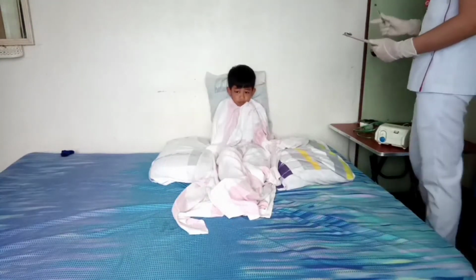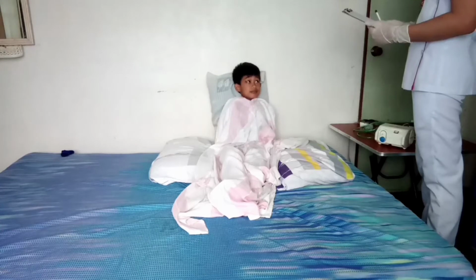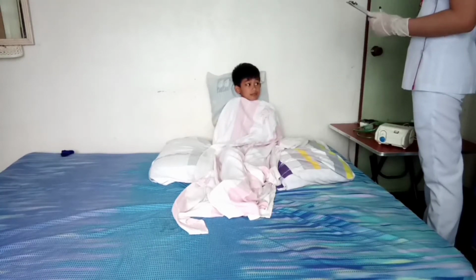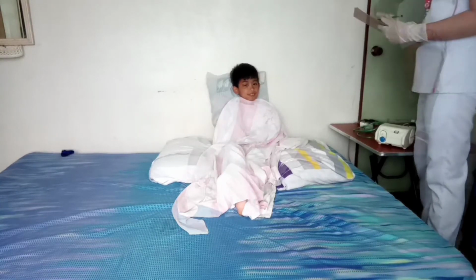And then we identify our patient, check the physician's order, and explain the procedure to the patient. It is to ensure the right procedure is done to the patient and to ensure the patient's cooperation and the effectiveness of the treatment.